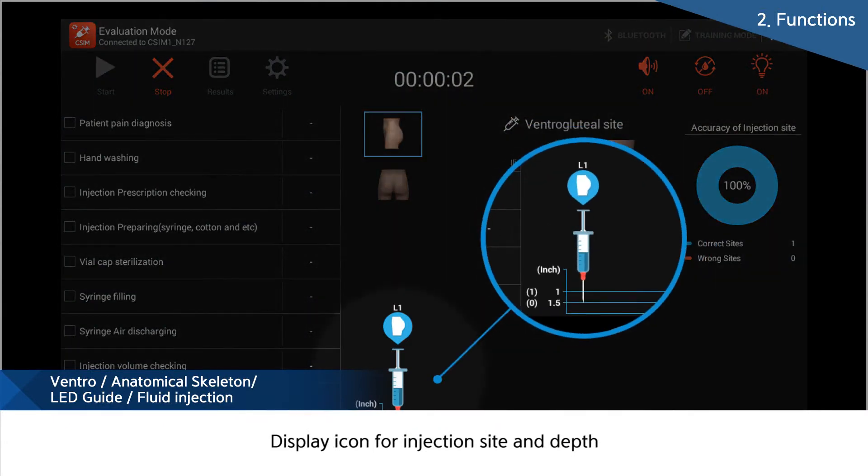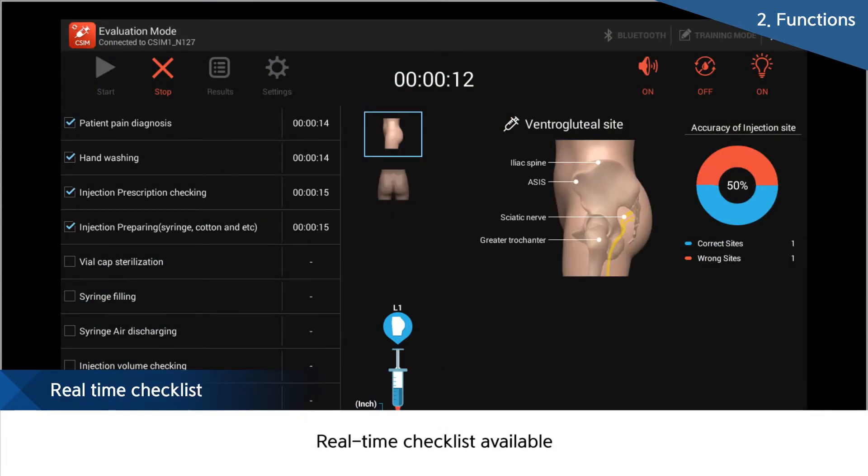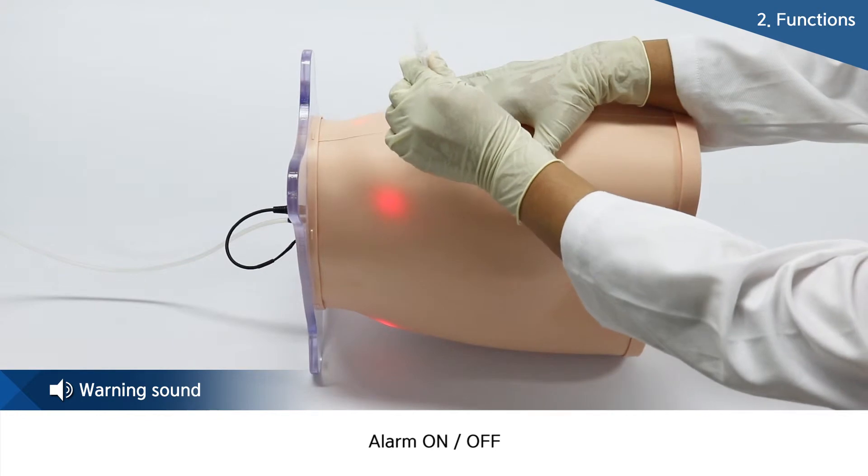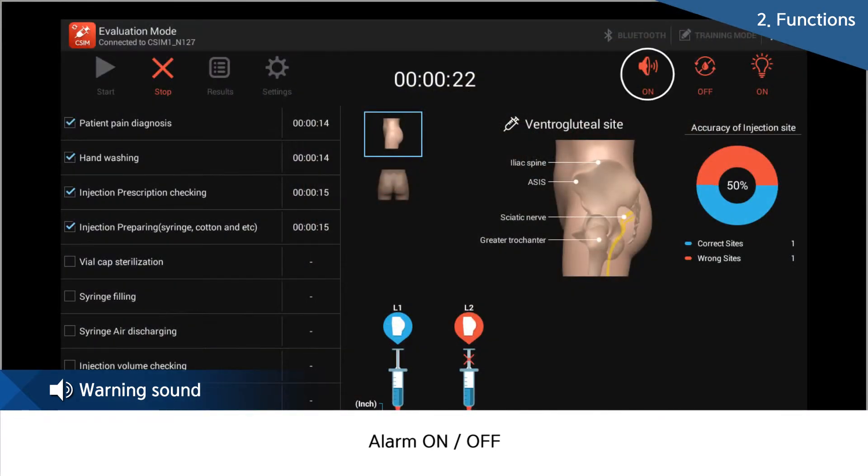During injection, the injected site and depth can be displayed on the screen. In addition, the user's training processes can be checked through the checklist made before training. The alarm will let the trainee know whether they have done correctly or not, and it can be turned on and off.